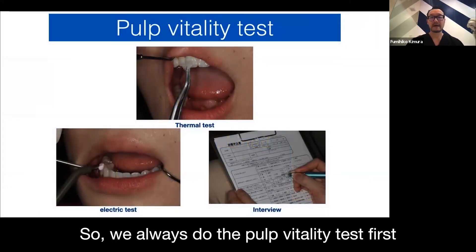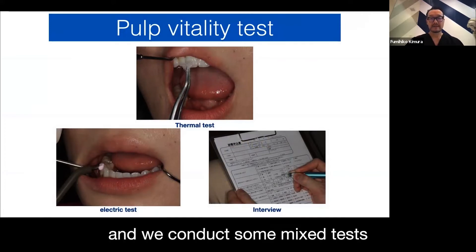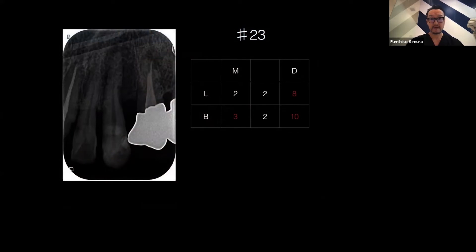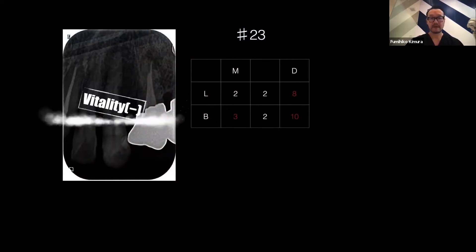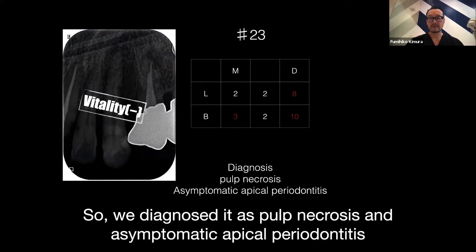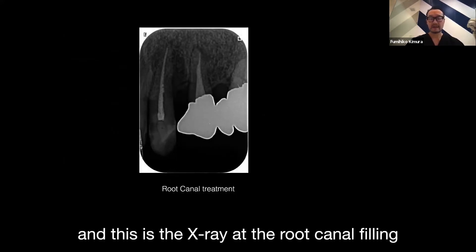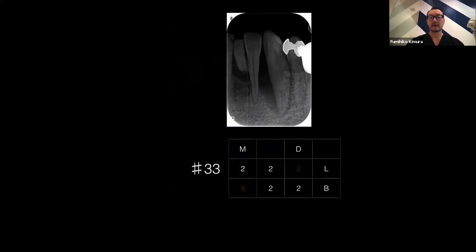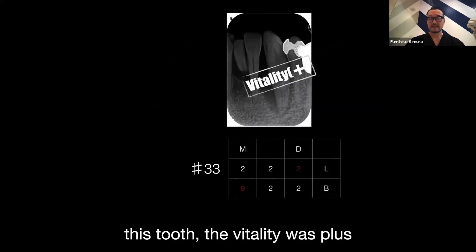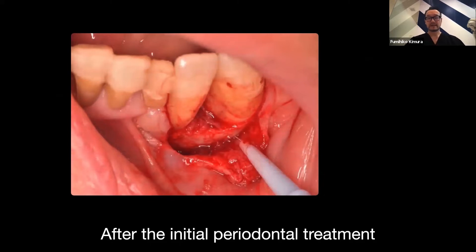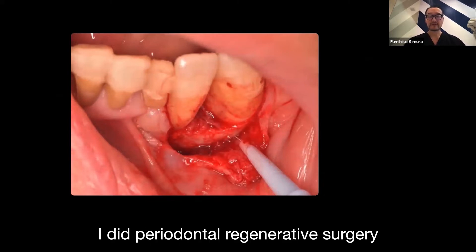We always do the pulp vitality test first. We conduct mixed tests including a thermal test, an electrical test, and an interview as well. Regarding number 23, vitality was minus. So we diagnosed pulp necrosis and asymptomatic apical periodontitis. We did the root canal treatment first, and this is the x-ray at root canal filling. For number 33, vitality was plus, so we diagnosed chronic periodontitis. After the periodontal initial treatment, I did periodontal regenerative surgery.